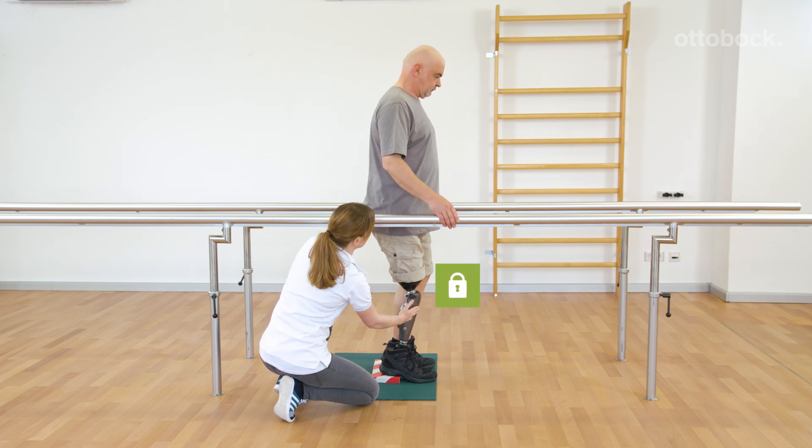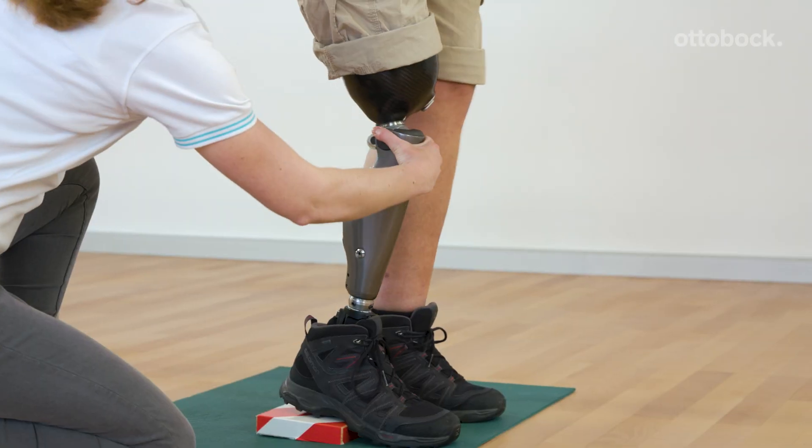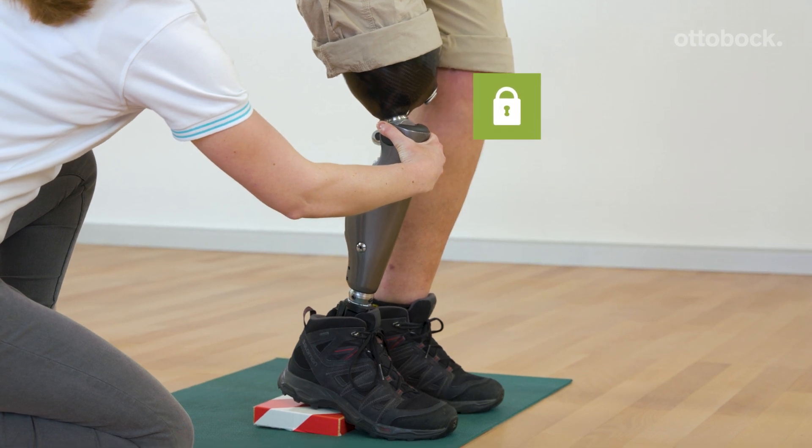Franziska shows Gerhard three possibilities to start walking out of the stance function. The easiest way is to take the first step with the prosthetic side.